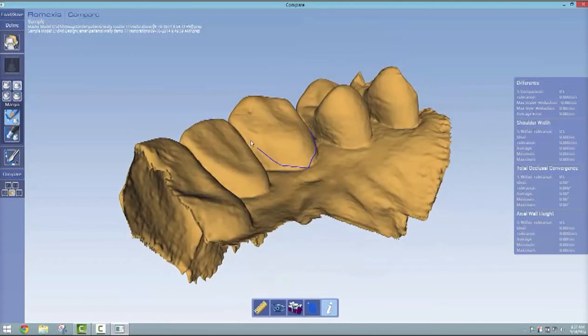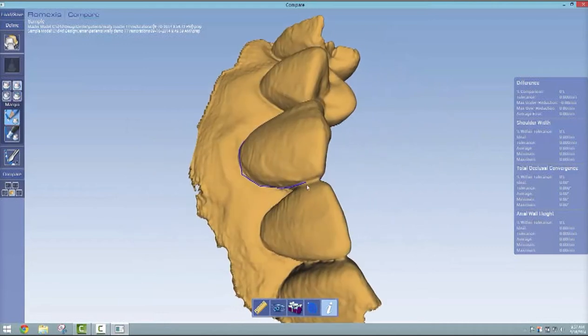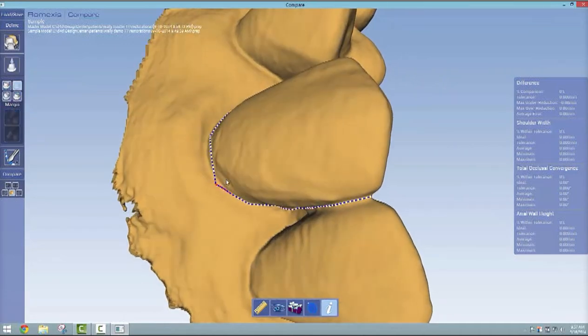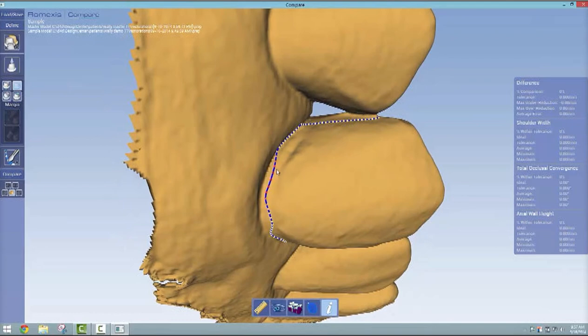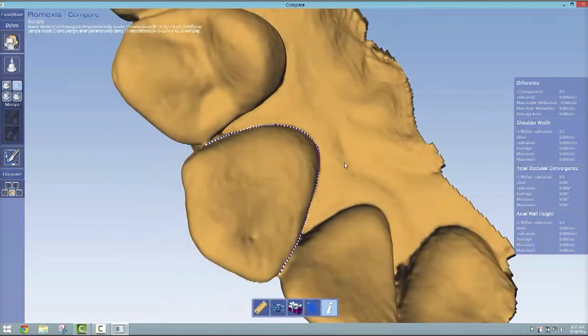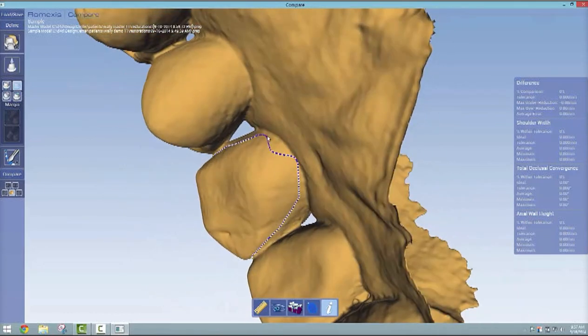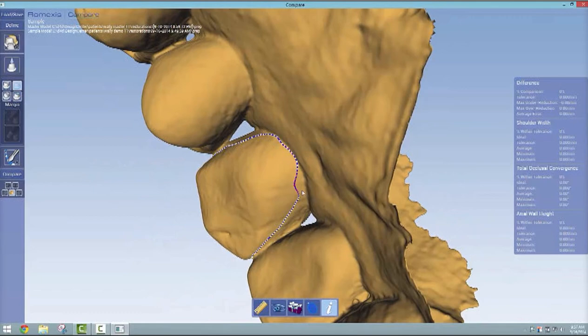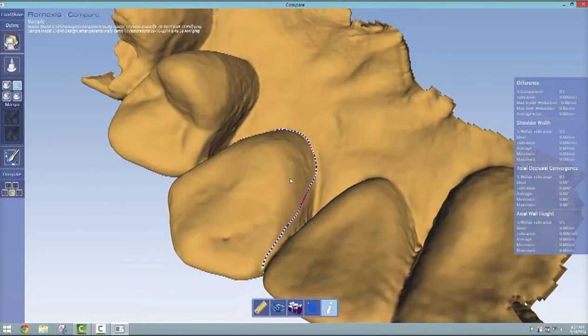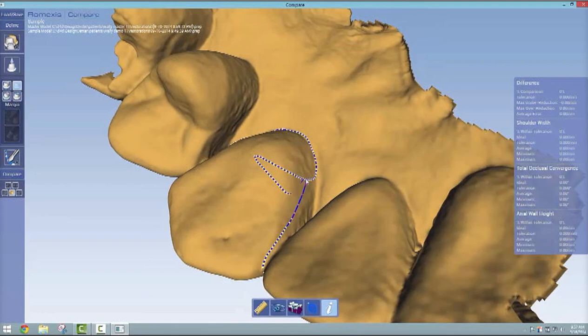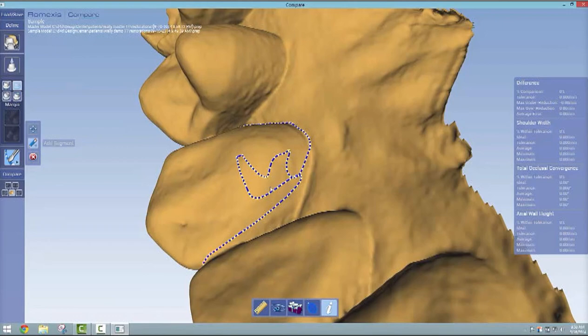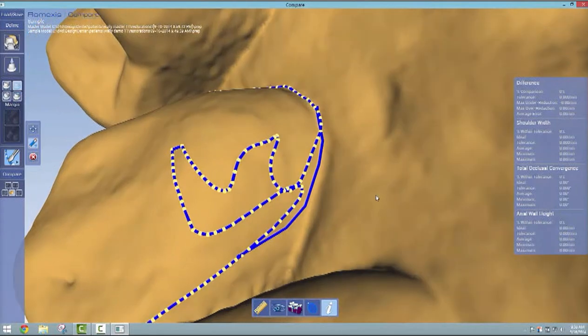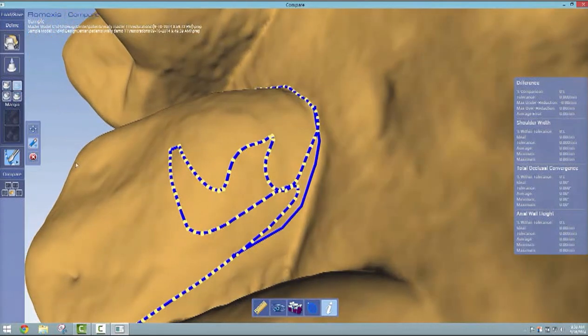We're going to start somewhere you can see and just click along the tooth to circumscribe the area you wish to grade. Faster is better, you don't need to spend so much time on this because you can edit it once you seal it by just dragging the lasso. If you single-click the line it straightens automatically. If you had some crazy defect like this by accident, you might need to use the add segments tool, that's the pencil right there. Click before the defect, then after the defect, and go back to the pencil tool to lock it in and it will heal that area.